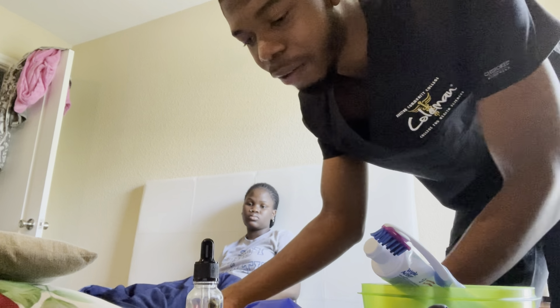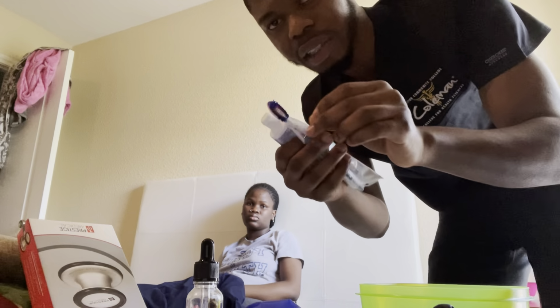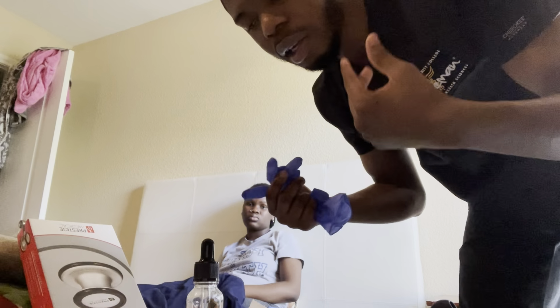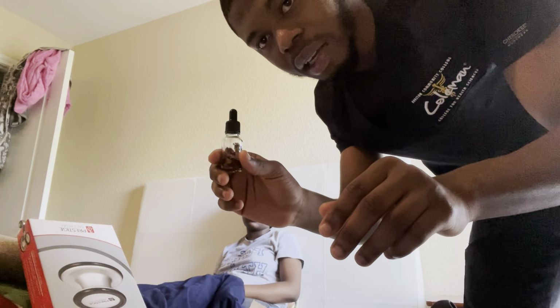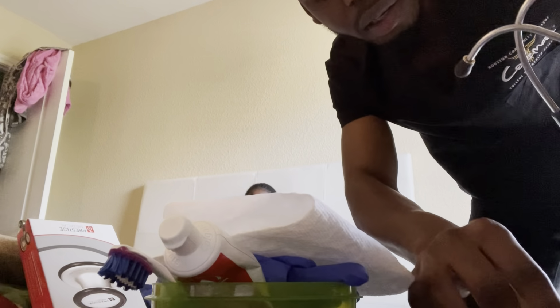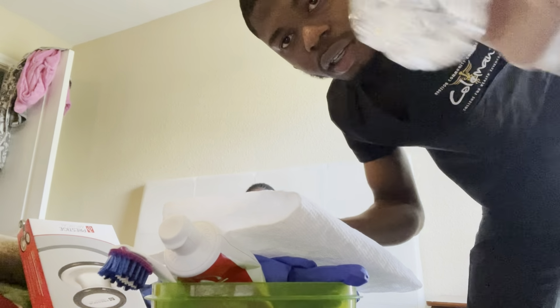The equipment needed for this procedure is basically a suctioning kit, a toothpaste and toothbrush to perform oral hygiene, a basin, a clean glove, a gown, a face shield, a mask, a hand sanitizer to perform hand hygiene, a drape, a pulse oximeter, a catheter, a stethoscope, a lubricant, a suction tubing, and a normal saline.